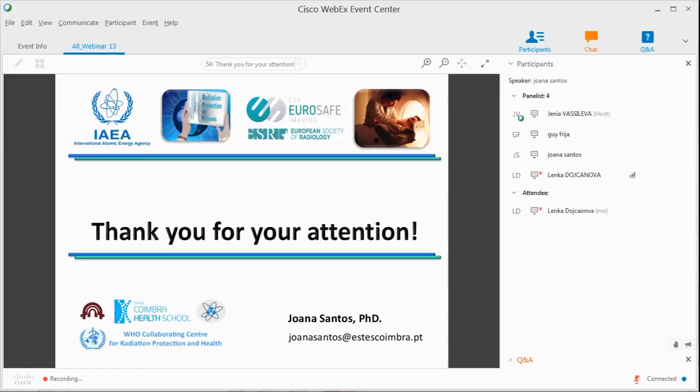There was a question here about, sorry, Jenny. If I can just add here that according also to the recommendations of the IAEA and ICRP, effective dose should never be used for individual patients; it is just an additional quantity for risk estimate.